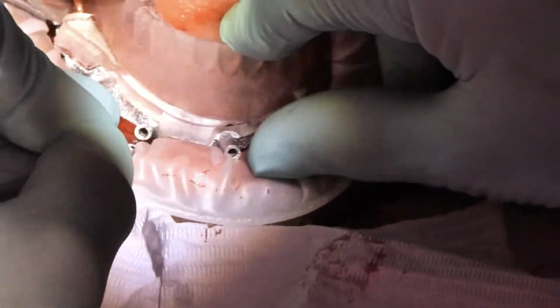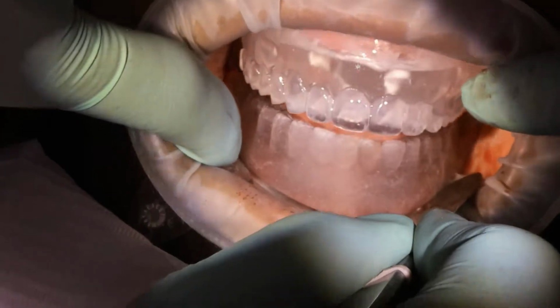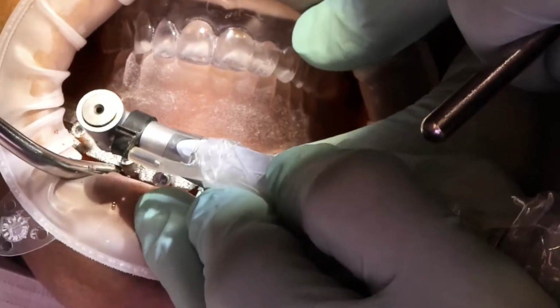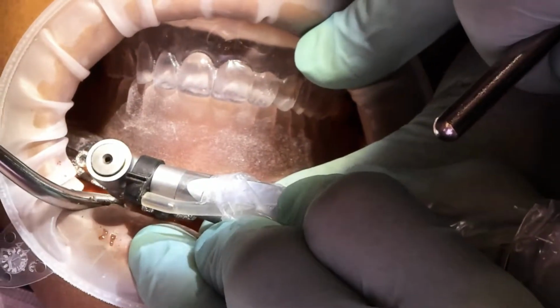As mentioned earlier, the double arch chrome edentulous surgery is unique. The pin guides are both seated at the same time, maxillary and mandibular pin guides. They are adjusted to make sure that there is no rock. They must have a stable, steady seat on the upper and the lower, and the bite must come together. Adjust a little bit as needed. So again, both pin guides are seated and adjusted until there's no rock and the occlusion comes together perfectly.